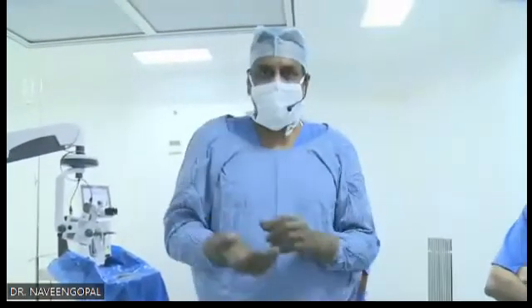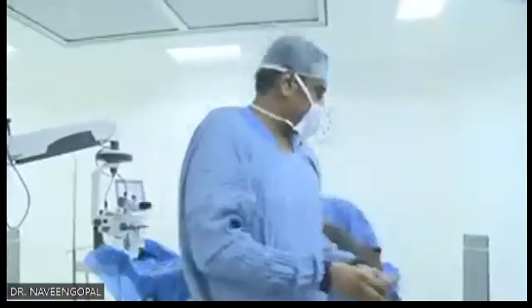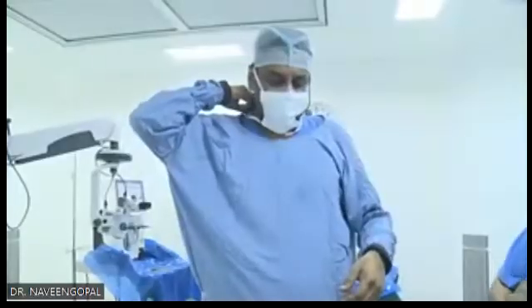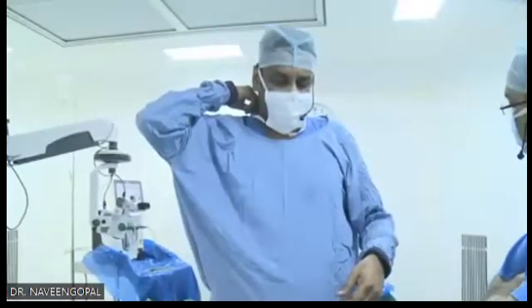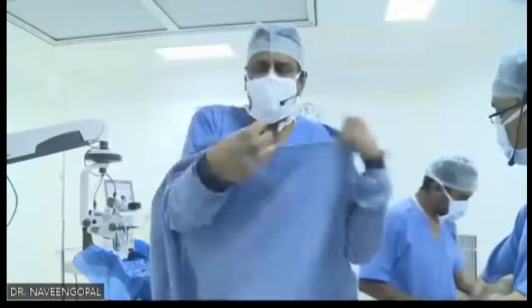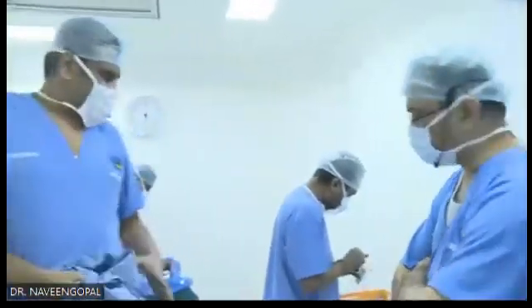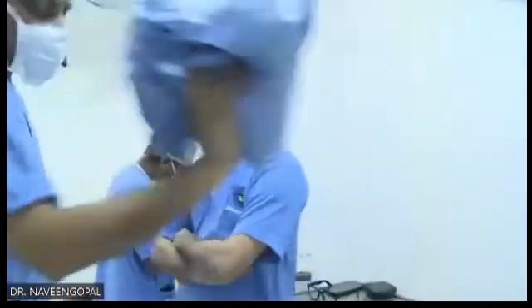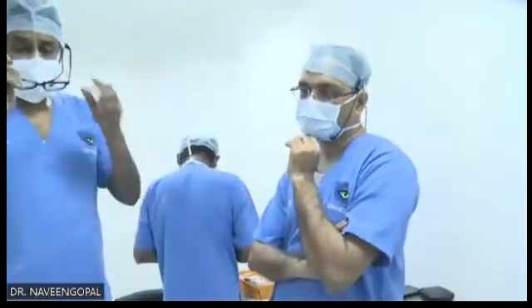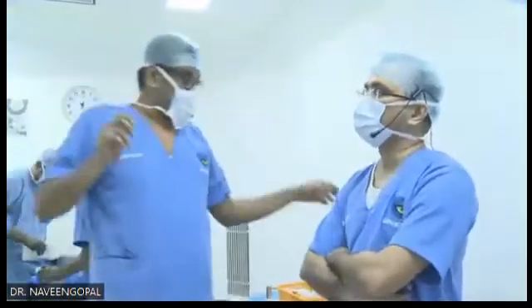Any questions? I'm happy to answer. Doctor, since we have the bigger central clear area, do you consider the angle kappa calculation for the active cases? In a patient with hyperopia, yes, you need to decenter the lens by 0.5 mm, considering the angle kappa. Correct. Good question. Yes, your angle kappa.